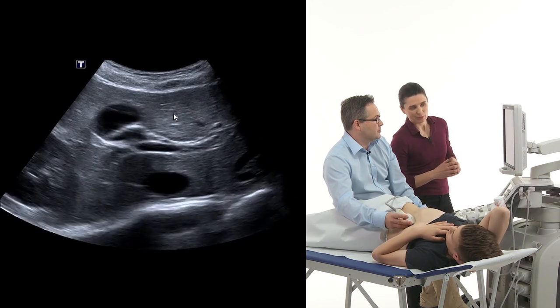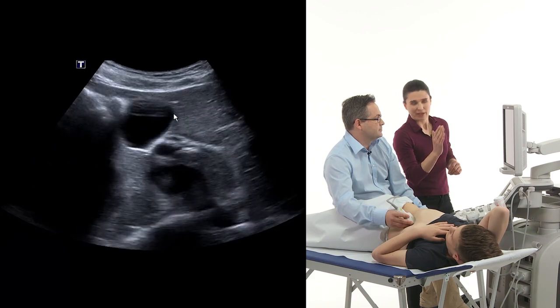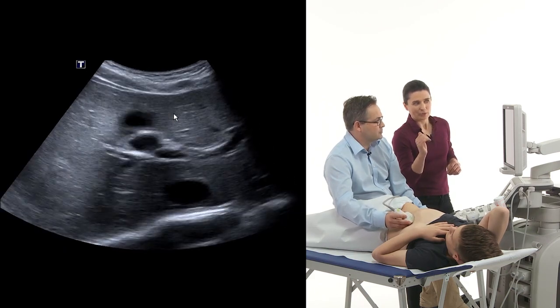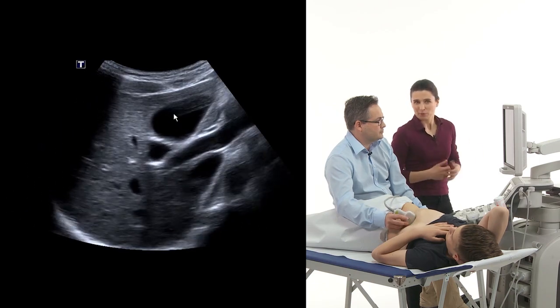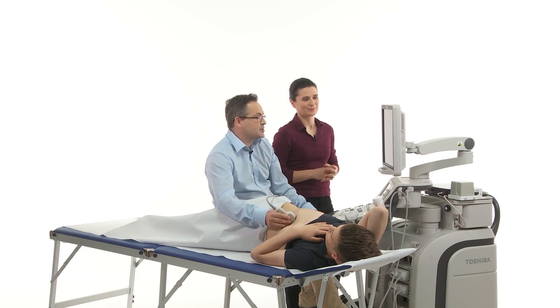I prefer the other view because I like to make a sweep along the costal arch and orientate on the lower border, on the caudal rim of the liver, to get a good view of the gallbladder. That's my preference. So you can use both of them and decide what's the best for you. So this was not so difficult.